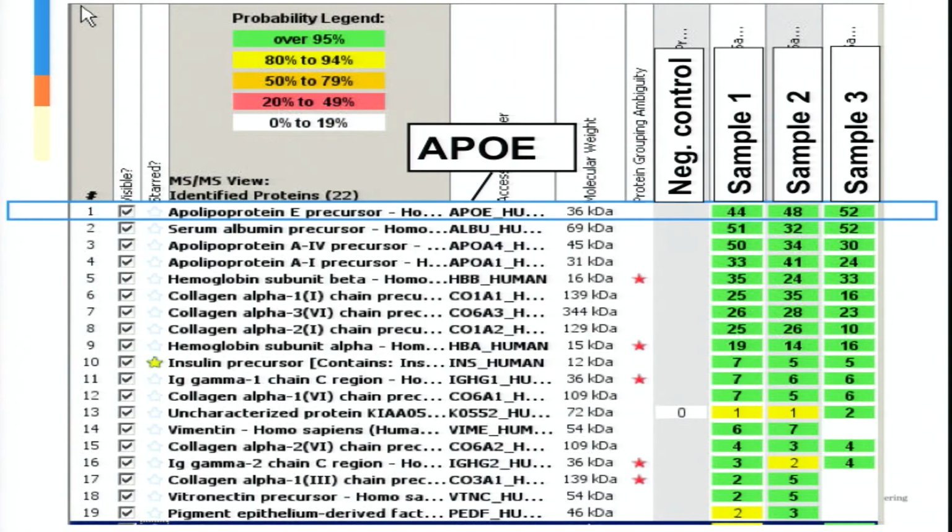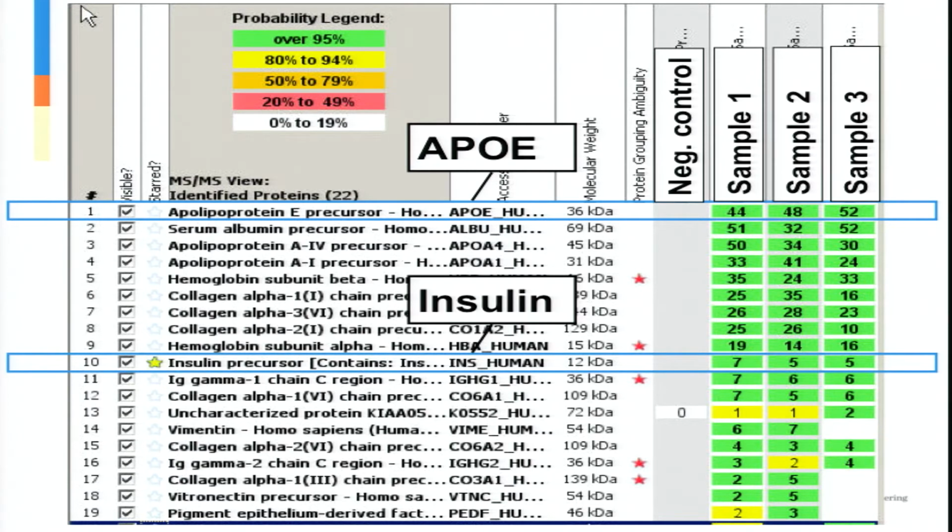We microdissected that, and this is how it looked. It's our list. You go through the proteins. Oh, looks like amyloid, and there's one that's starred there. Insulin. So, wow, what's happening here? This is insulin in abdominal fat. What does that mean? And so I rang the surgeon and asked whether the patient was diabetic, and he said yes.